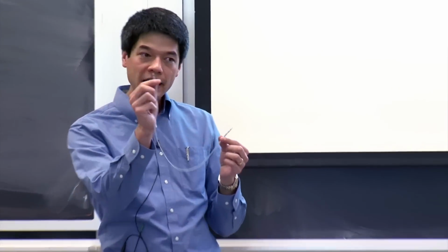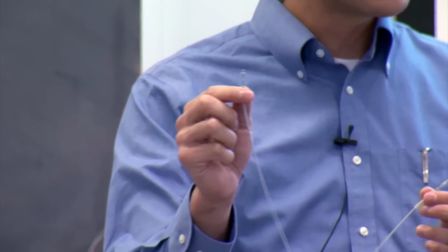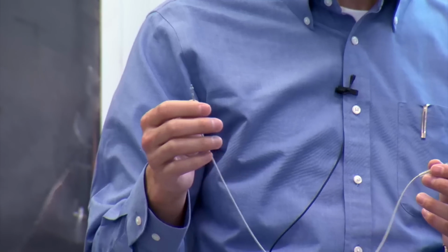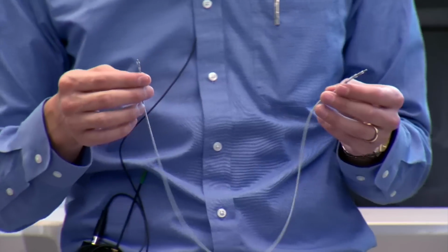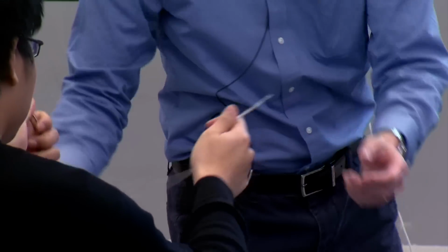You can see there are little tines on the end, and on some of the devices, there's both a sensor, so it can sense your cardiac rhythm, and there's also actuation. You can send shocks, both small and large, to either pace the heart or to basically reboot the heart if there's a chaotic rhythm. It's a very highly advanced device. It's a steroid tip piece of metal on the end, so it doesn't bind to the tissue. You can pass that around. It's basically a USB cable, right?